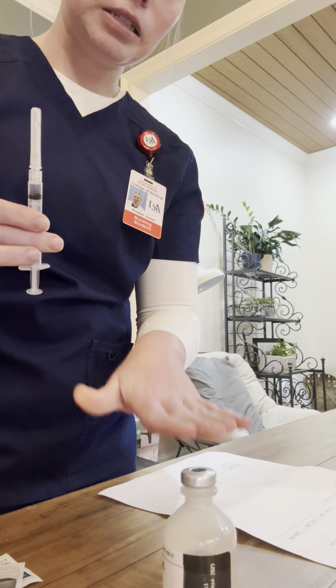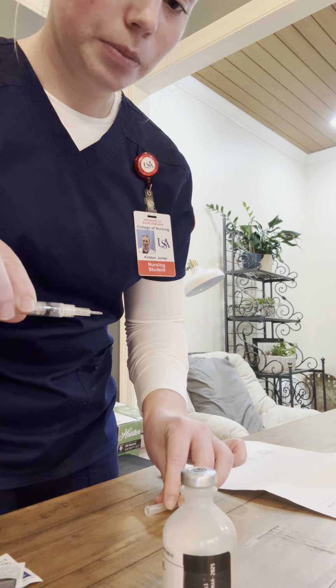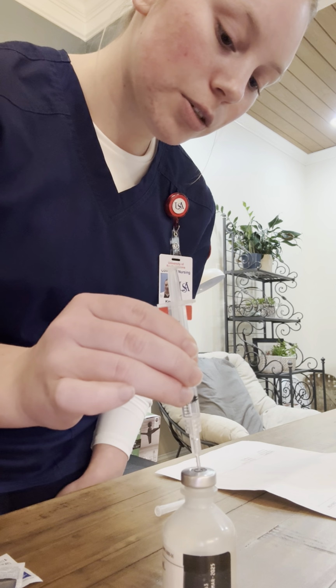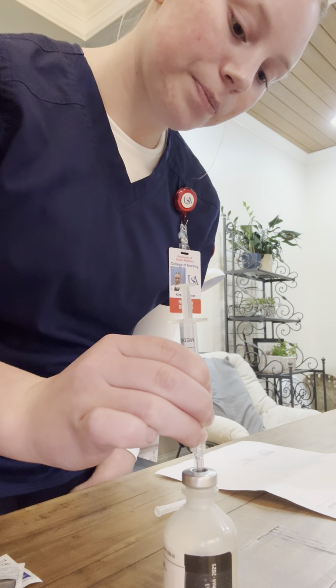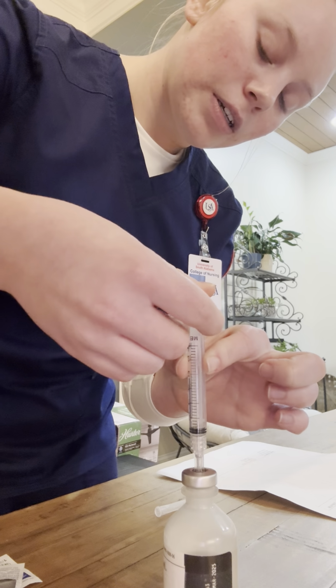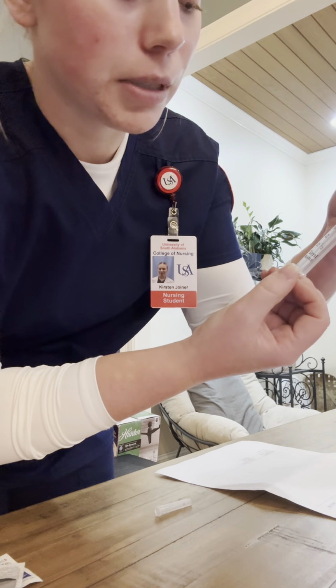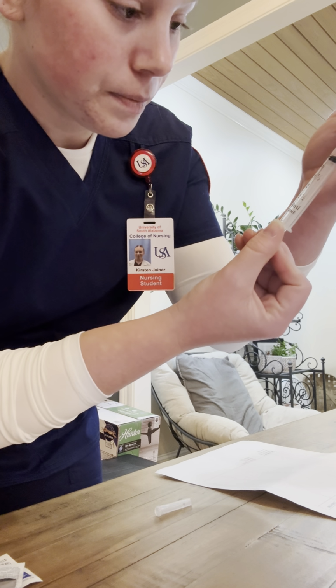I have already cleaned my vial, so I will remove the cap and place it here. I will insert the syringe into the vial using lots of pressure. I will inject the air into the vial, and then I will draw up 0.5 milliliters of morphine sulfate.